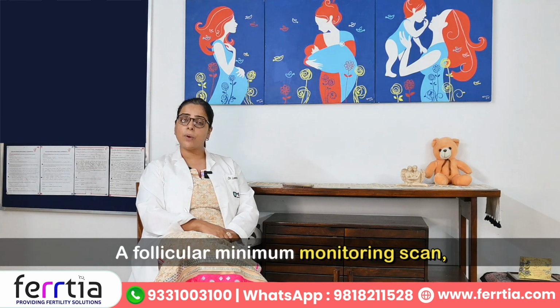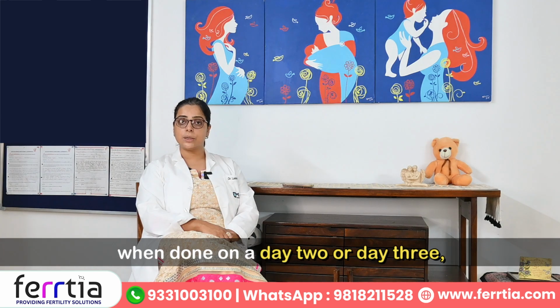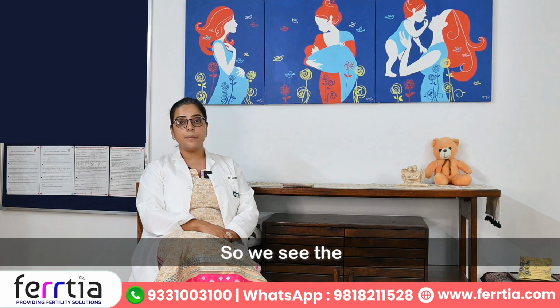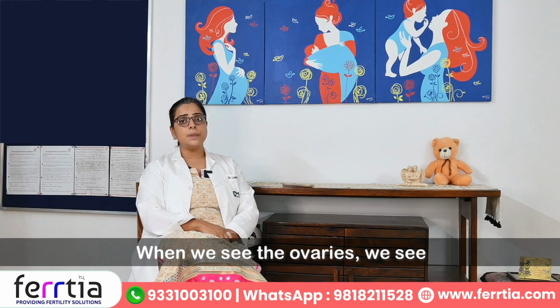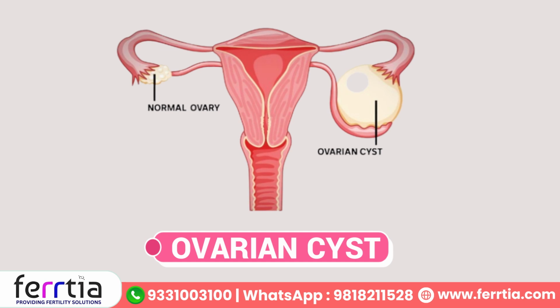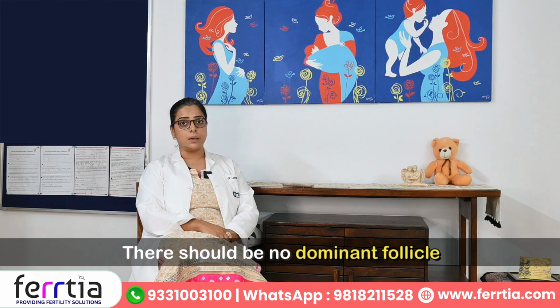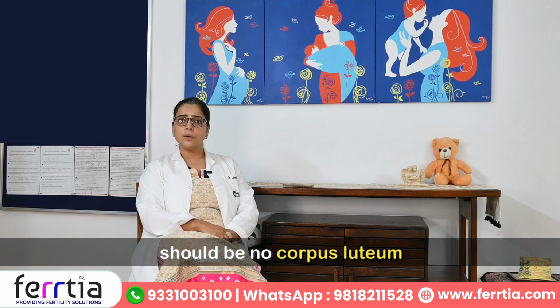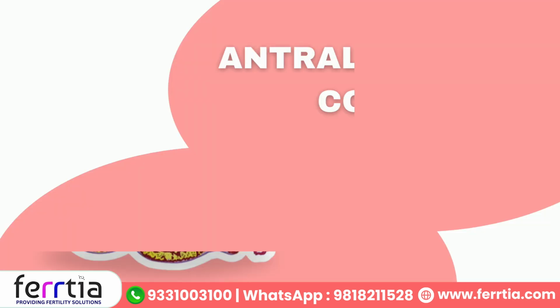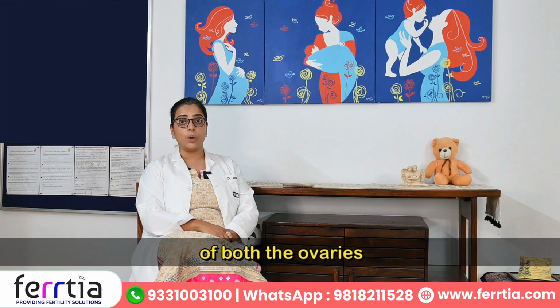A follicular monitoring scan, when done on day 2 or day 3, what parameters are seen? So we see the ovaries. When we see the ovaries, we see that there should be no cyst in the ovary, there should be no dominant follicle on day 2 or 3, there should be no corpus luteum on day 2 or day 3. We see the antral follicle counts of both the ovaries.